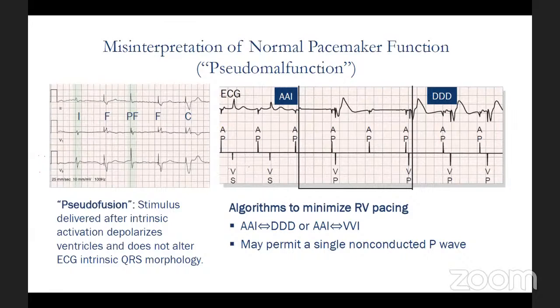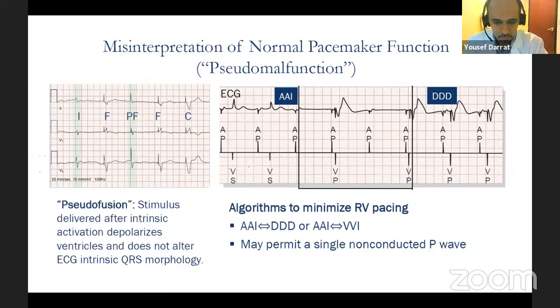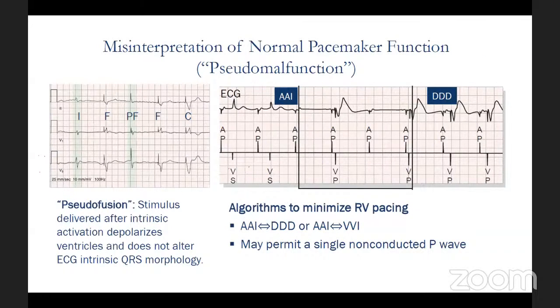This is classical Medtronic. Boston has a different algorithm, and I forgot what it's called. VIP. Well, VIP, exactly. AV search. Oh, AV search, yes, exactly.